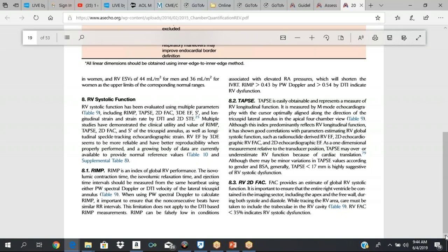So especially when you're doing exams and you talk about volume, once you see it, three-dimensional echo is the most accurate means of assessing volume anywhere in the heart. So another common question that they usually bring: you're gonna do, say, ejection fraction or whatever. Three-dimensional echo gives you excellent volume assessment, so you should use it.